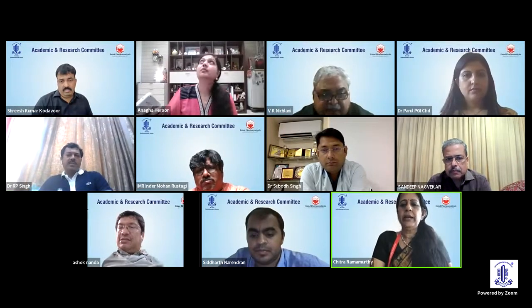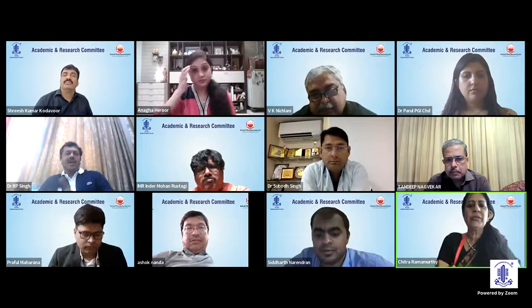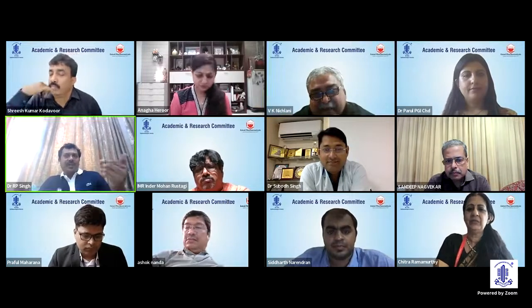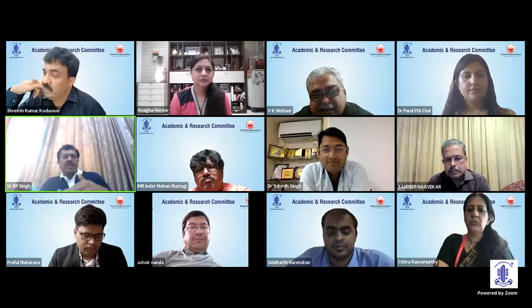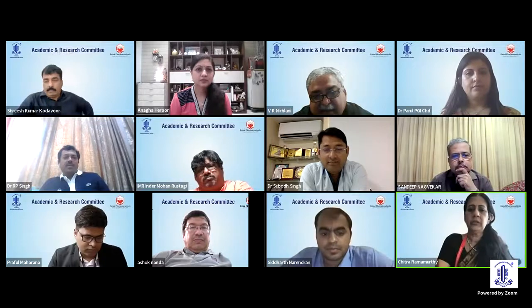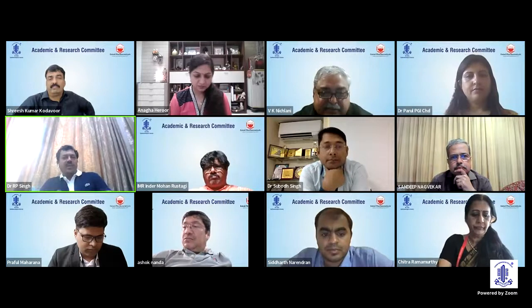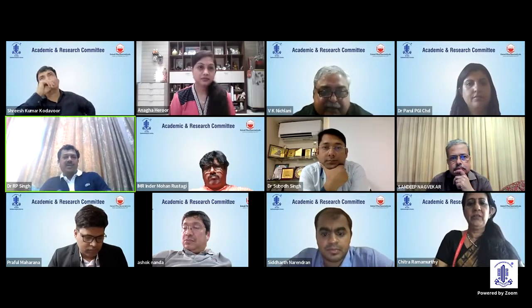I agree with all the points, but I still feel that in this particular case, let me say, it was a little hurried. Putting a lens blindly in such cases is also a little difficult, because once you put the lens, you may have a lot of lens matter behind the lens also. So try to address all the lens matter as much as possible to have the least post-operative inflammation, as you can have intense post-operative inflammation in such cases.